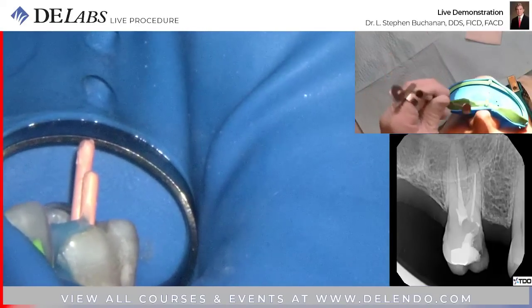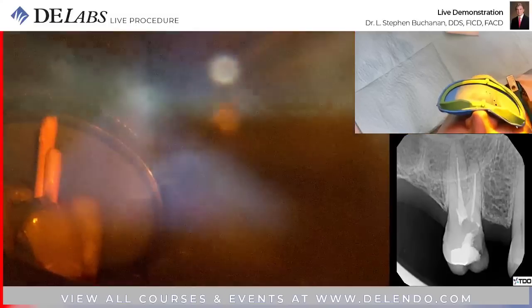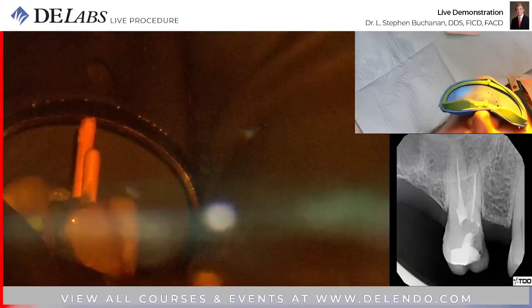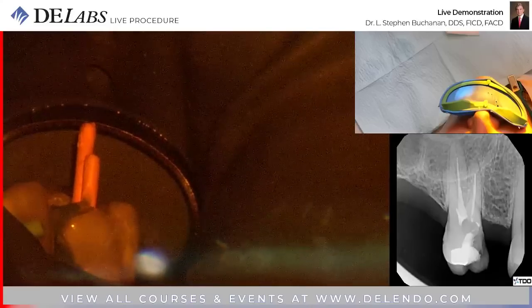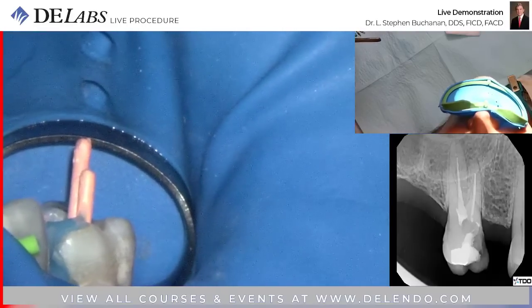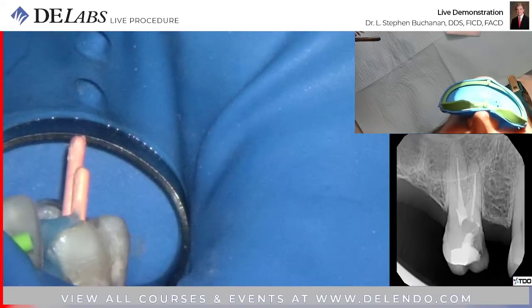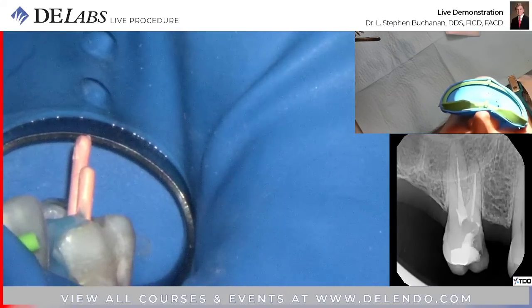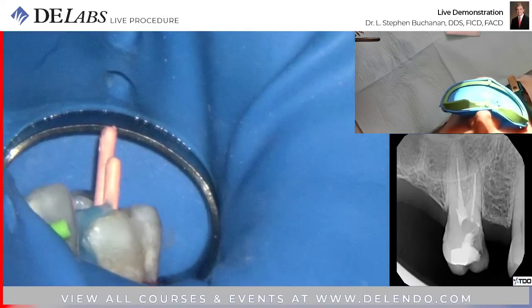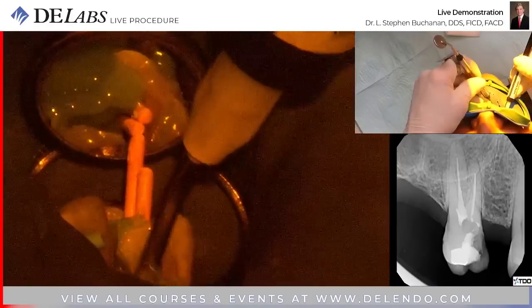So at this point, if you weren't using the GentleWave, I would be setting up to do negative pressure irrigation. We'd be ready for a soak. I would fit cones, I'd take radiographs, and we'd soak it. So it's really advantageous. Going to start using hypochlorite now. Fitting the cones, I'm exchanging used up solution for fresh solution. There's actually a research study showing you can refresh the solution and get an effect apically in small canals just by putting a cone in place and taking it back, because you displace it all and you get fresh solution in there. So some of the simplest mechanical solutions are going to work for us.